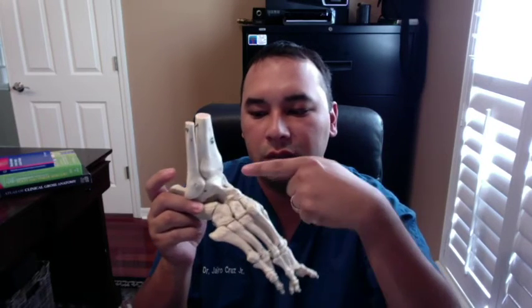So typically with the scope, you can do this very minimally because the incisions for the scope and the entrance of this instrumentation are very tiny. In fact, the incisions are approximately 6 millimeters in length. So that's about the diameter of a pencil eraser, if you want to look at it that way. And there's essentially two portals that we make in the ankle, and that's where we place the instrumentation into the ankle joint to be able to visualize the defect and also correct the defect with proper instrumentation. Again, surgical intervention is avoided at all costs, but sometimes this simple, minimally invasive procedure can help the patient greatly improve their symptoms and pain and their quality of life.